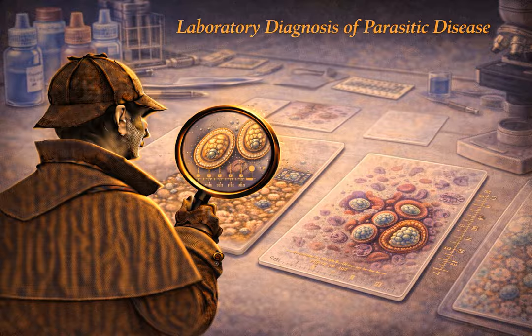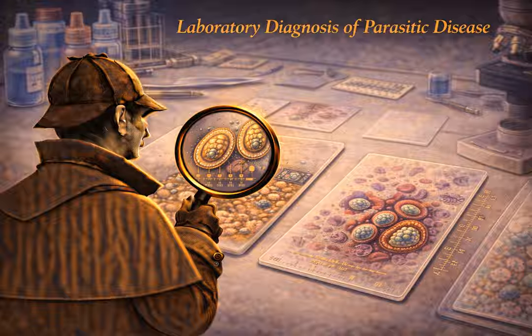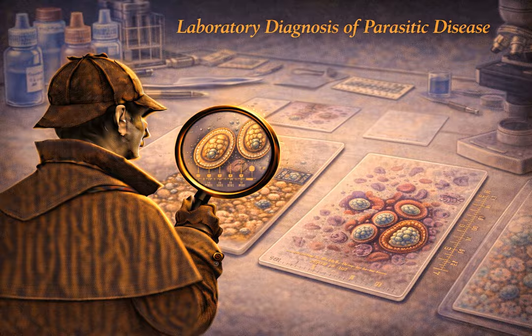Moving on to section 6, urine, sputum, and skin. Who even knew parasites could be in all these places? Let's start with urine. The massive target here is Schistosoma haematobium. This is a trematode, a blood fluke. And it has a bizarre evolutionary predilection for the venous plexus, the network of veins directly surrounding the human bladder.